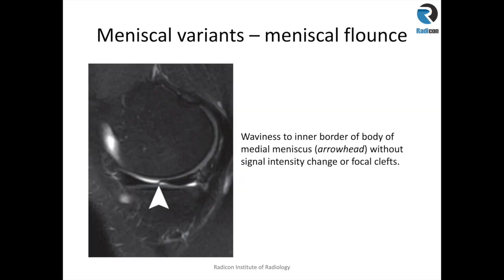Another meniscus variant is meniscus fluens. There is a hypothesis that this is a result of previous trauma. This is not a tear and no intervention is required as long as you know what it looks like. What you get is a waviness of usually the inner free margin of the meniscus body. If you can describe and label it as meniscus fluens, then in conclusion you can say there is no tear. It is an important variant to recognize and dismiss.